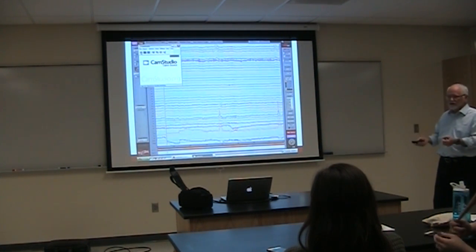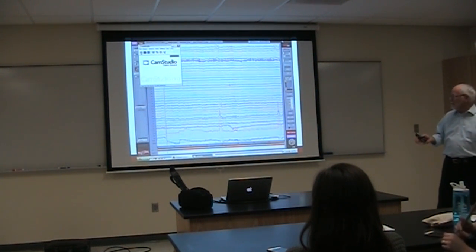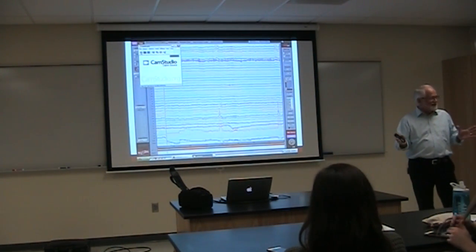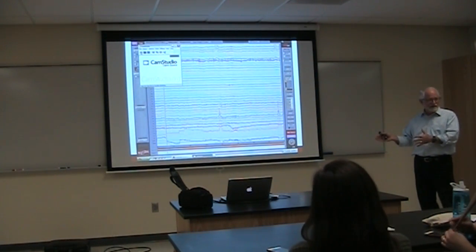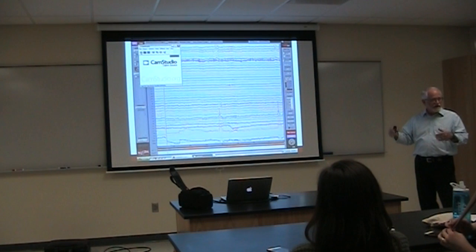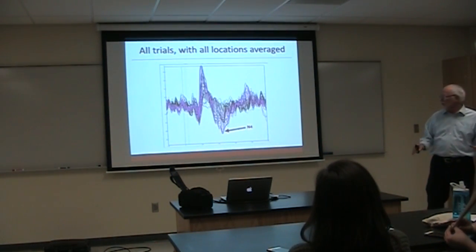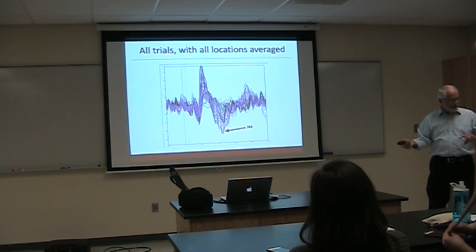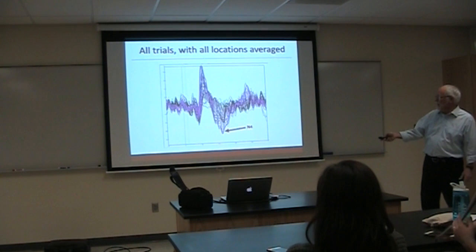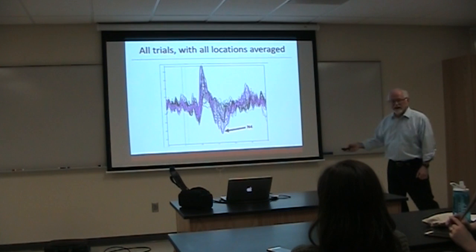I mean, if you look at raw EEG, unless you're some kind of super genius that has a brain focused for this, it really makes very little sense until you do the filtering and averaging. And then you get something that looks like this, and you can start making sense of it. Notice what I've done here. I've flipped the scale. And so now we're talking about, if you look over here, these are positive numbers and these are negative numbers.